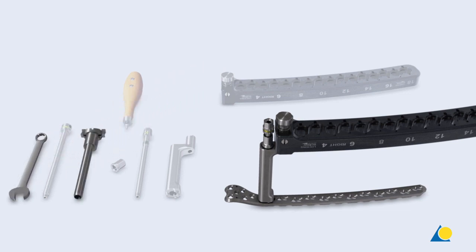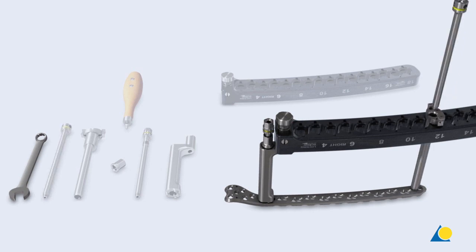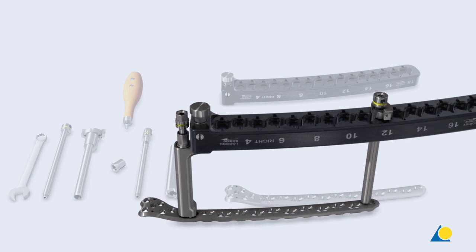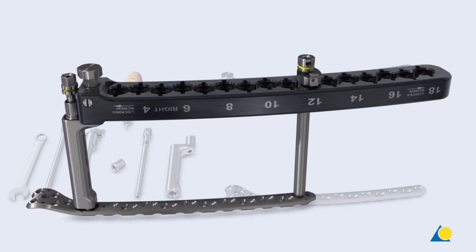Insert a guide sleeve into the hole in the aiming arm that corresponds with the most proximal combi hole in the plate. Insert the wire guide through the guide sleeve and thread it into the plate. Using the combination wrench, tighten the nut on the locking bolt to compress the insertion handle to the plate. This step ensures that the holes of the aiming arm are correctly aligned with the plate holes, and that this position is secured before inserting the plate. Remove the wire guide and guide sleeve to prepare for plate insertion.